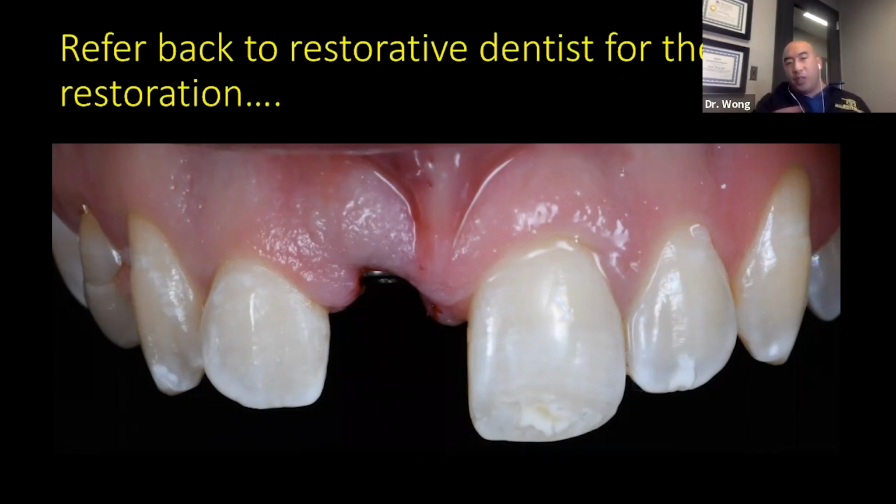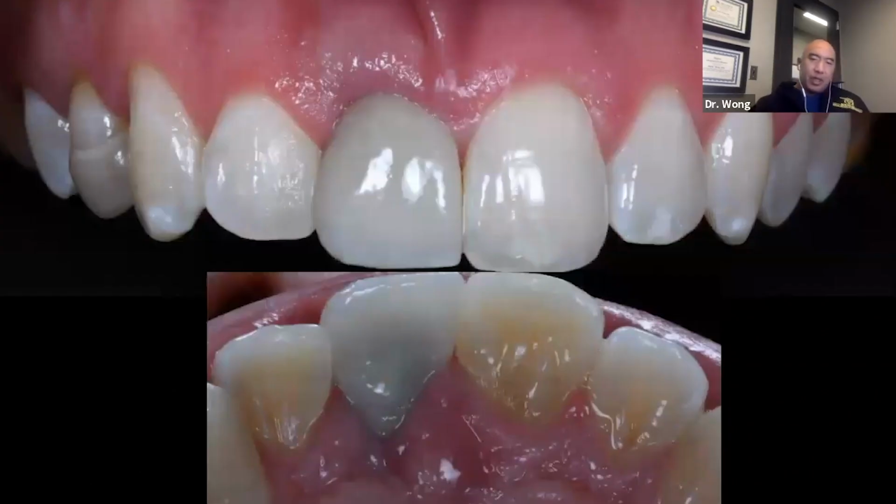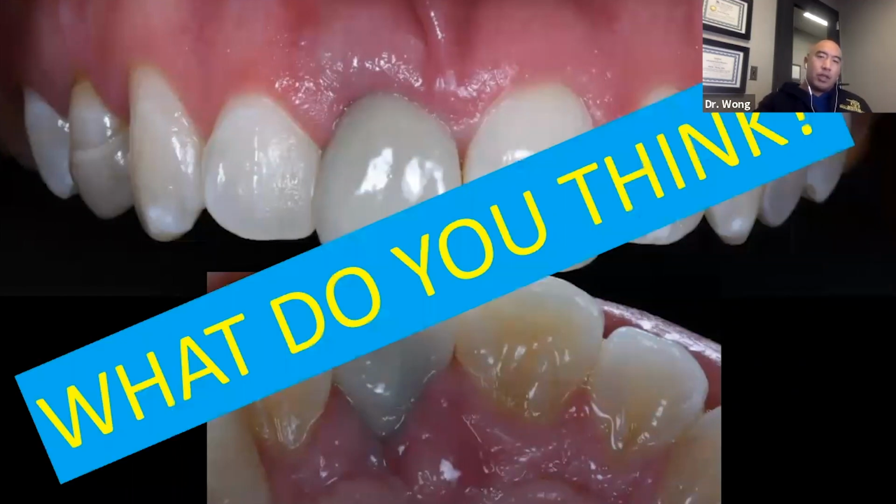The problem is if you only do that and leave everything up to the lab, this is something typical of what you would get sometimes, right? Shades off, contours are off, it's cemented instead of screw retained. So the patient's just not happy. Okay, and I asked you guys what you thought. I'm sure we're all on the same page here.